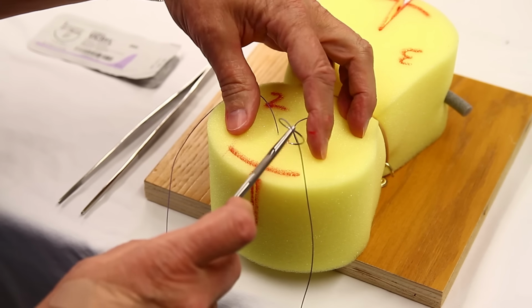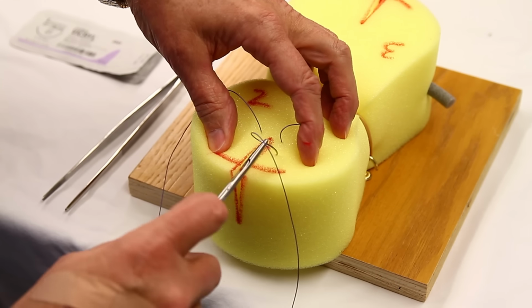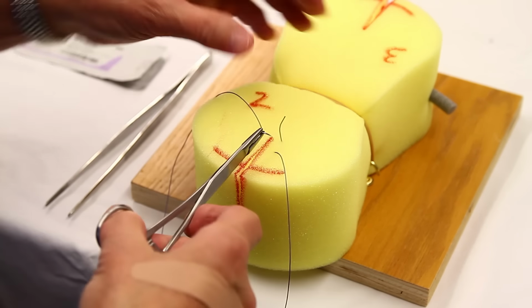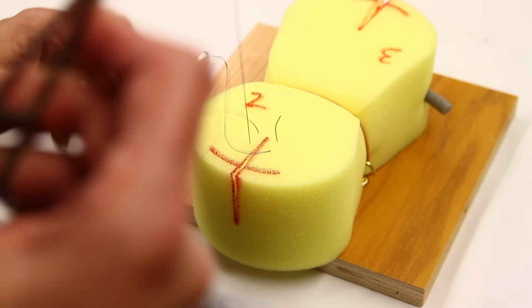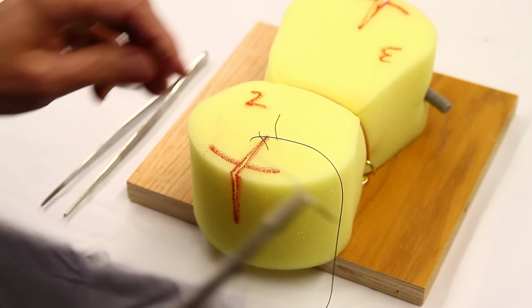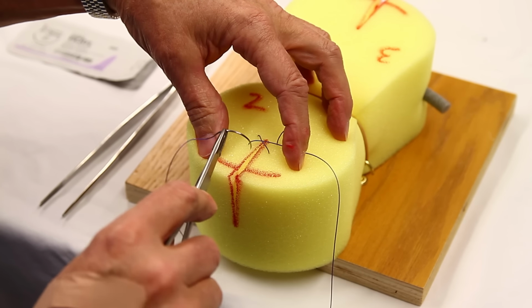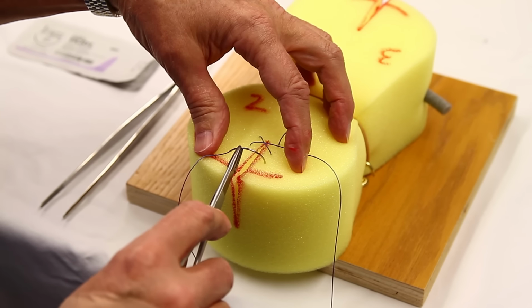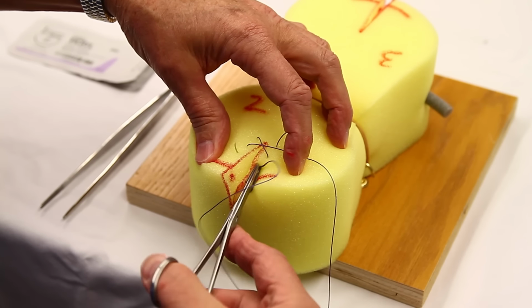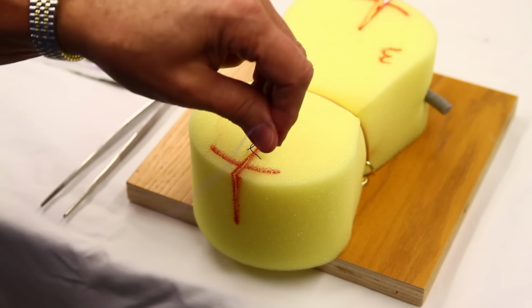The next suture moves down about 1 centimeter, reaches in and comes up, and these are simple locking sutures, so we want to include that on this simulation. Again, move down 1 centimeter, back from the edge of the laceration about 1/2 centimeter, and take a full bite and pull it through so it locks.